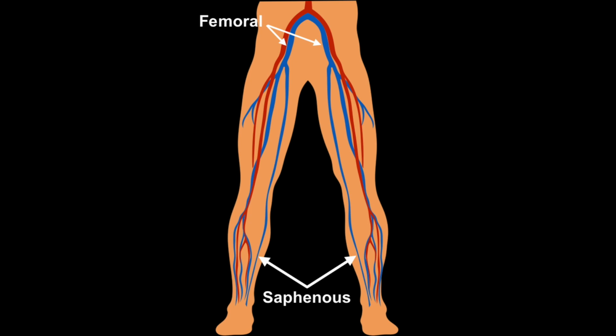Some people still do that without ultrasound guidance, and if you're doing any of these, kudos to you. I feel it's safer, and so I use ultrasound when I can. And I'll also look at the saphenous as a peripheral vein.